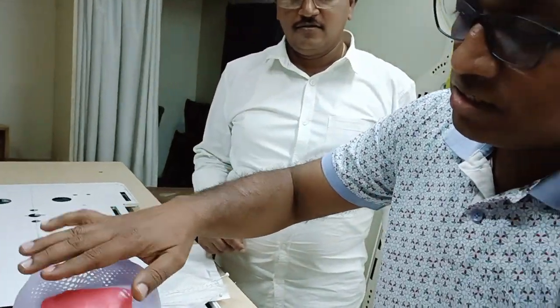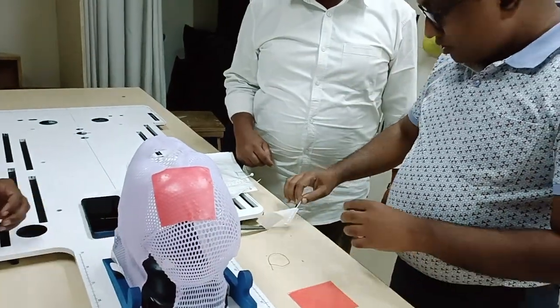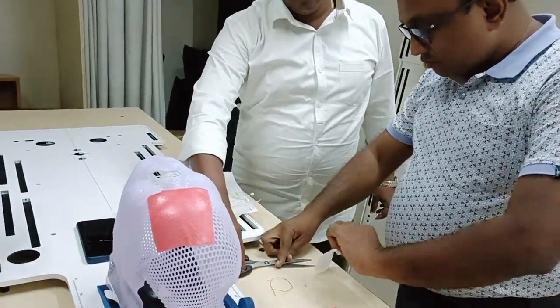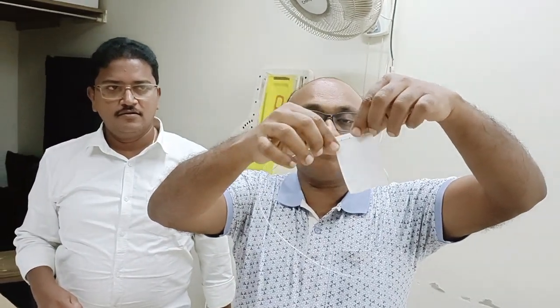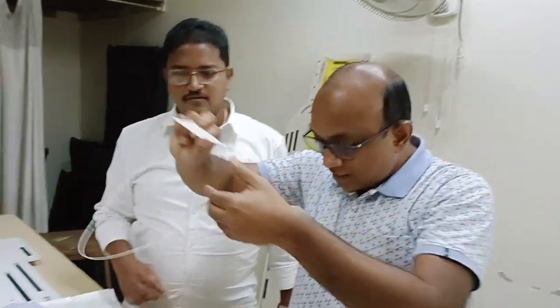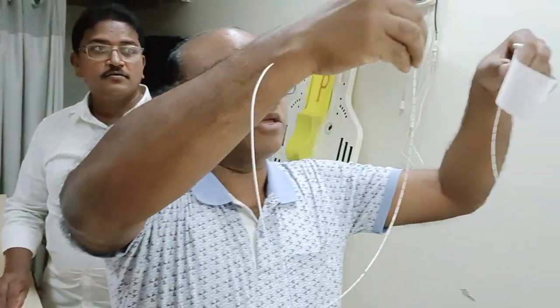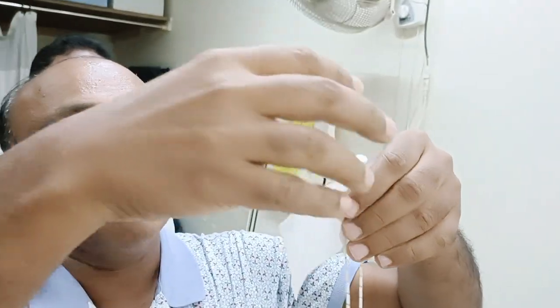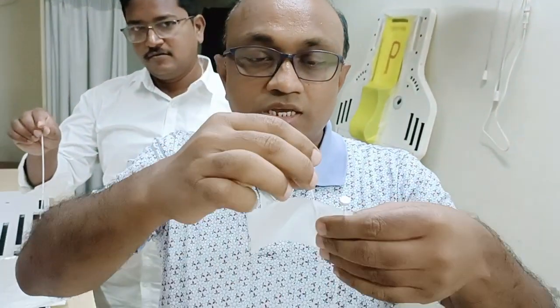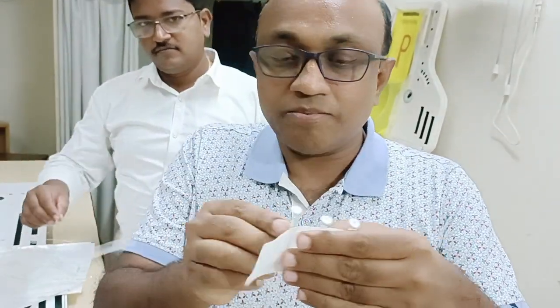Next, take a micropore — a bigger cloth micropore is better. Take the brachy wires and place them at around 1 to 1.5 cm gaps in a line, like I am putting here. For example, if I am placing 5 wires, you put them like this.